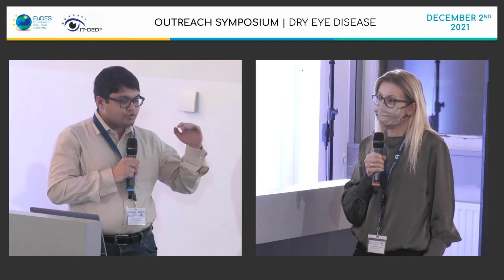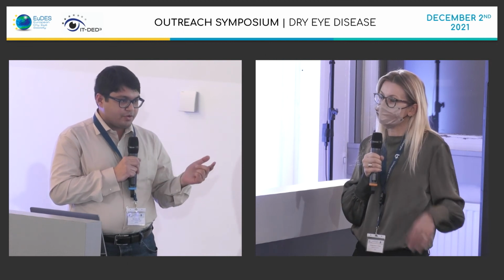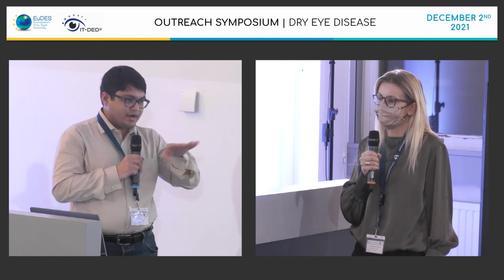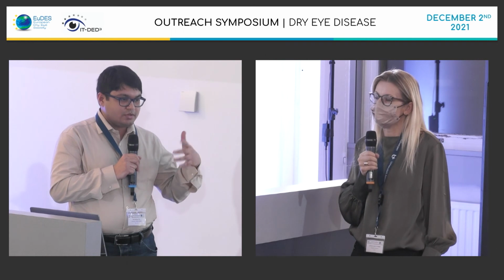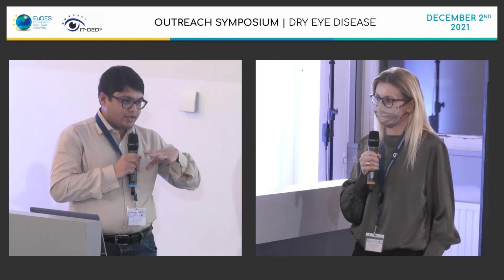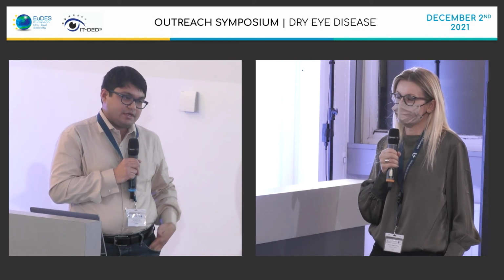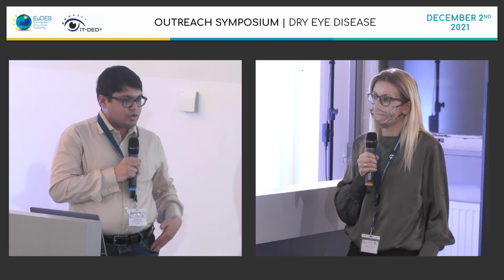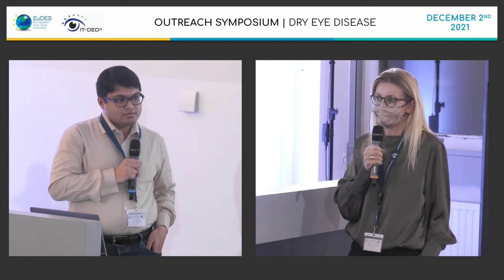We not only put a threshold on the length, like 50 micrometers, but also another threshold on the number of dendrites, like branches, present on the cells. If it is more than 2, so it has branches, then we consider it a transition stage cell, the same as the mature stage cells. So we count the length and how many dendrites are there. Okay. Yeah.